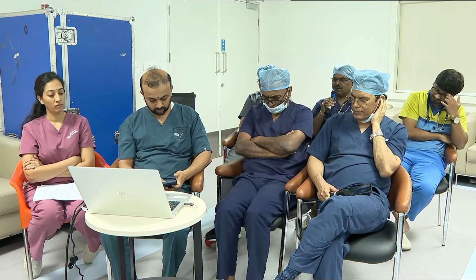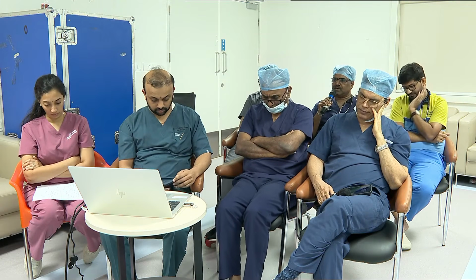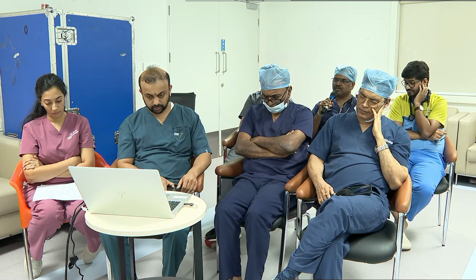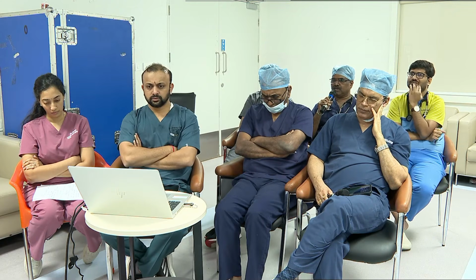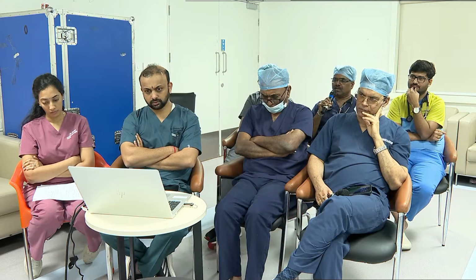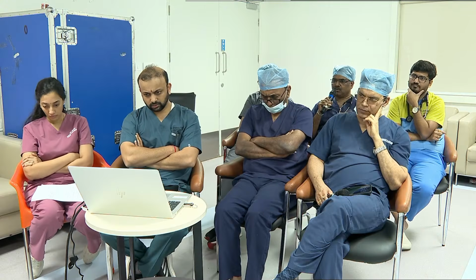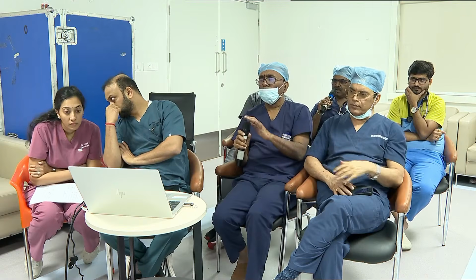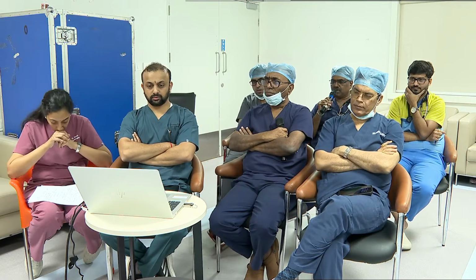Yeah, that was nicely dealt. I think you have already explained the entire anatomy of the TAVI, because in TAVI, the CT evaluation of the anatomy is more important. In fact, your entire planning should be before the procedure itself. So 70 to 80% of the work is in the anatomical evaluation of the access route and the entire route, the tracking of the valve, followed by the angles, and then the site of valve deployment.